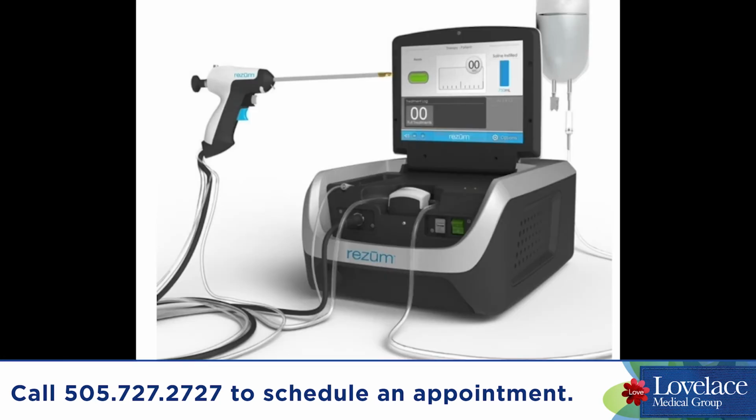So the Rezum procedure is also a transurethral procedure. Each treatment takes 9 seconds. You can do multiple treatments in one session. This is done again in the operating room for comfort. Using this handheld device, it's placed in the reverse direction, the way the urine comes out, transurethrally.